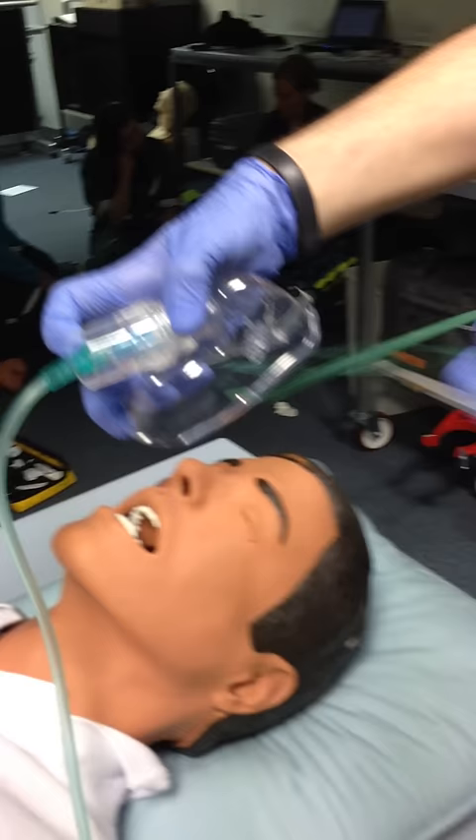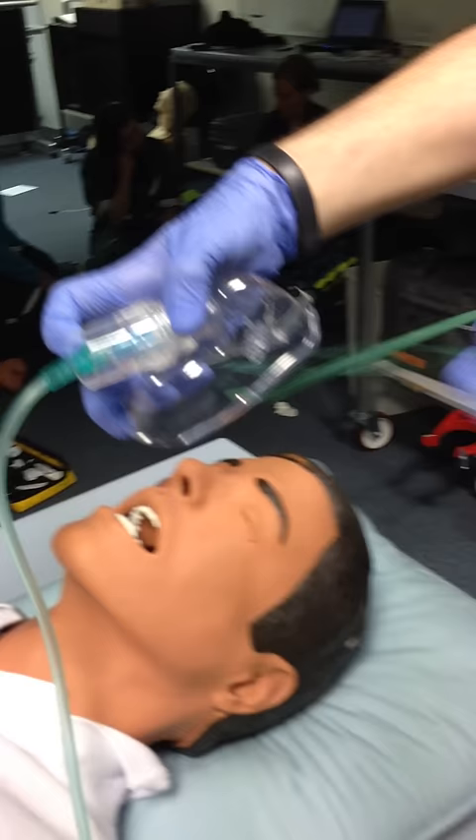This just goes onto the patient — more gracefully, hopefully, in real life. Now once that's on, just make sure you can see that the mist is disappearing on inspiration. That gives a good indication that there's good tidal volume. If there isn't, it could be in for a few problems.